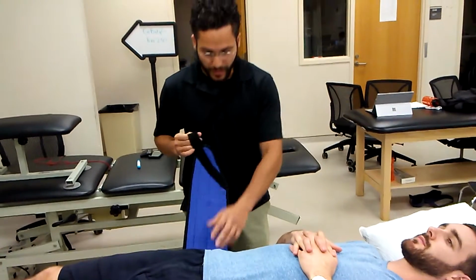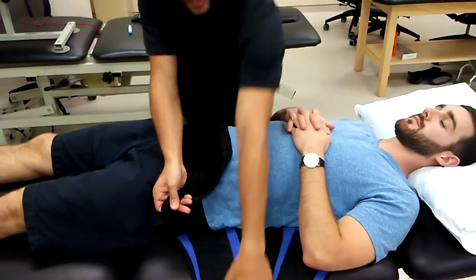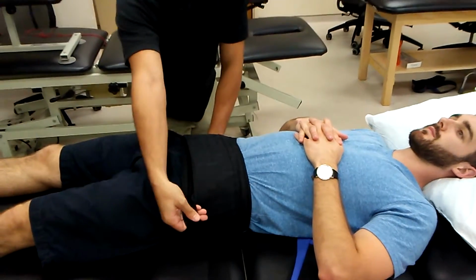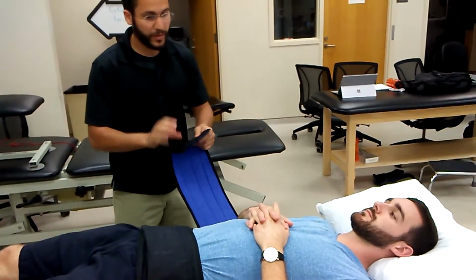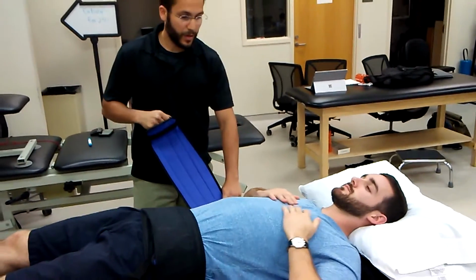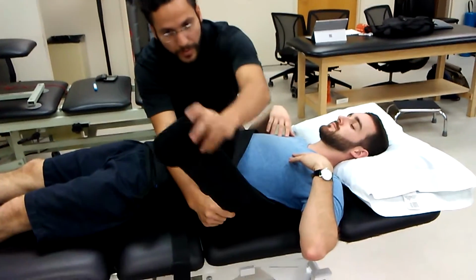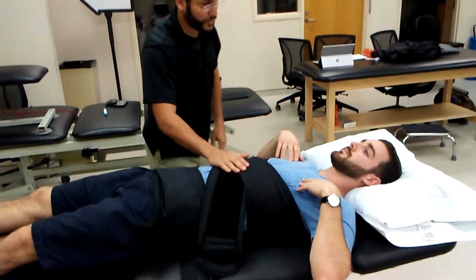So then after it's in line, which it is, I'm going to tighten it by crossing it over. Not to be too tight, but snug. Is it okay? Mm-hmm. Well, good. Next one is going to be the thoracic belt. So the same thing. I'm not going to make it too tight. I'm going to cross over. Okay. Can you breathe? Are you okay?